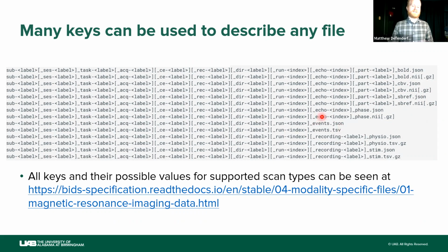You'll also have events files for event-related designs and block designs for functional data, physio, and stimulus files, and all of these are really created during the conversion to a BIDS format.